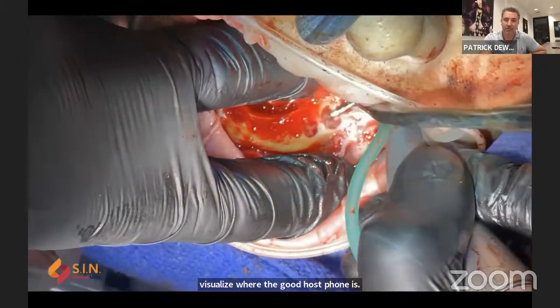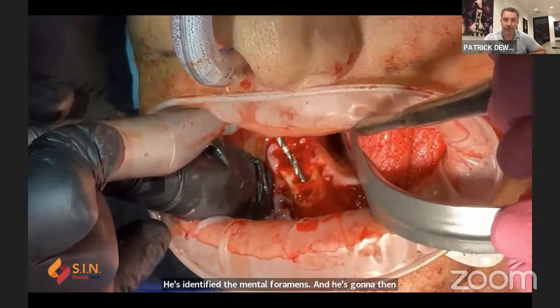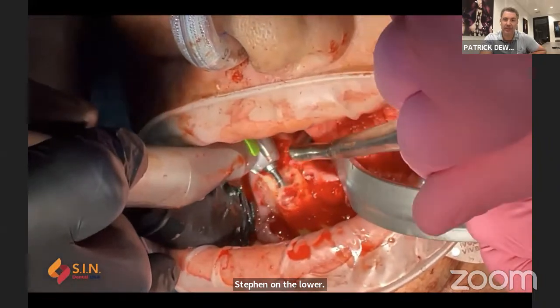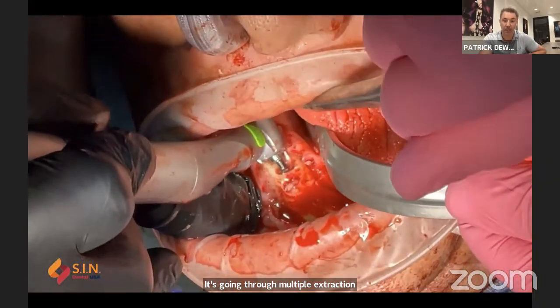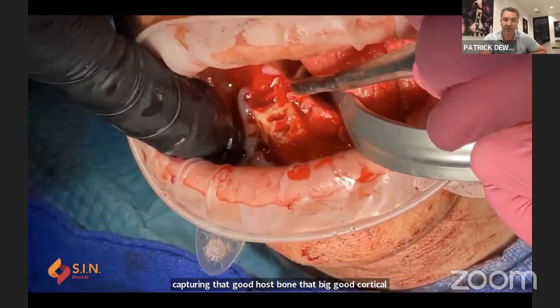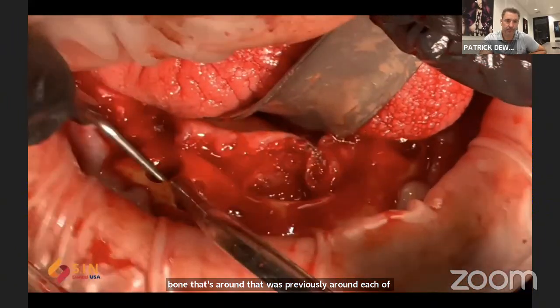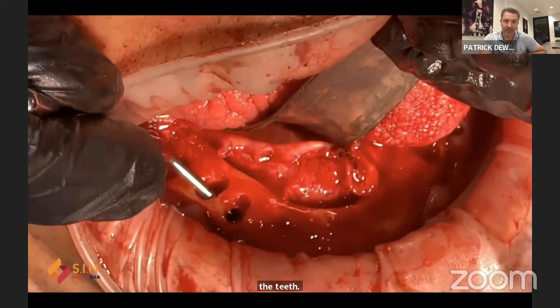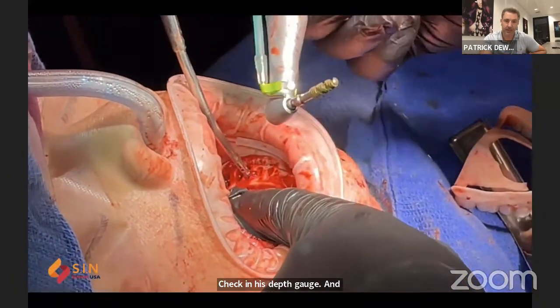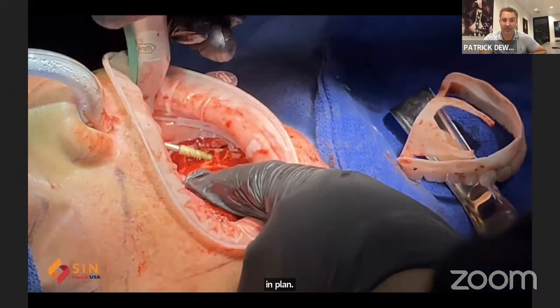And he's going to then prep his distal sites first, even on the lower. He's going through multiple extraction sites, so he's capturing that good host bone, that big good cortical bone that was previously around each of the teeth. Checking his depth gauge. And now he's going to place his implants. Again, his distal implants first, then he's going to go to his anterior sites.